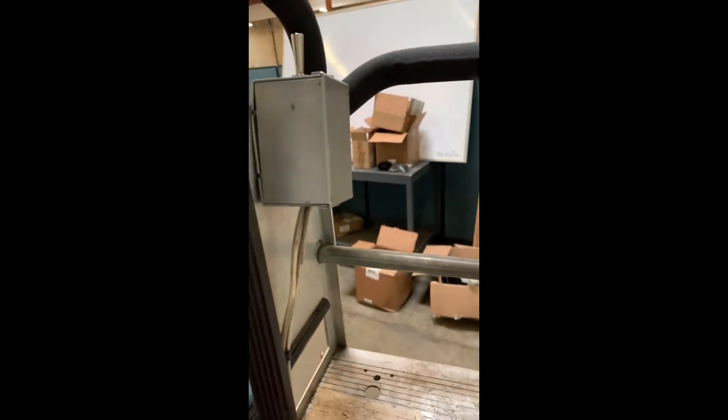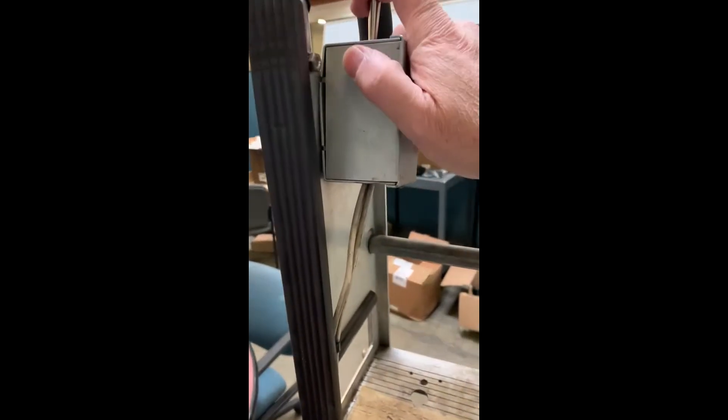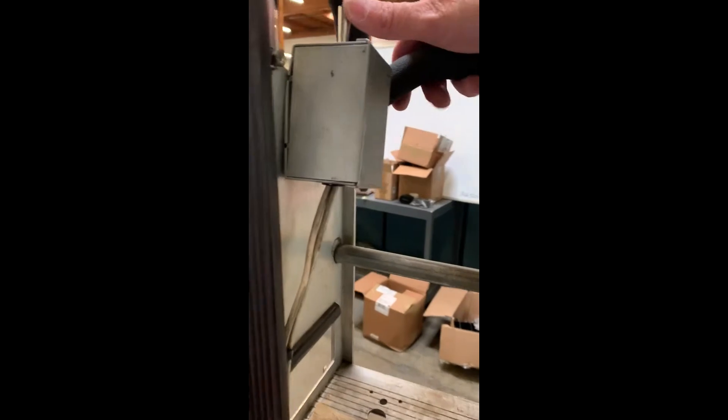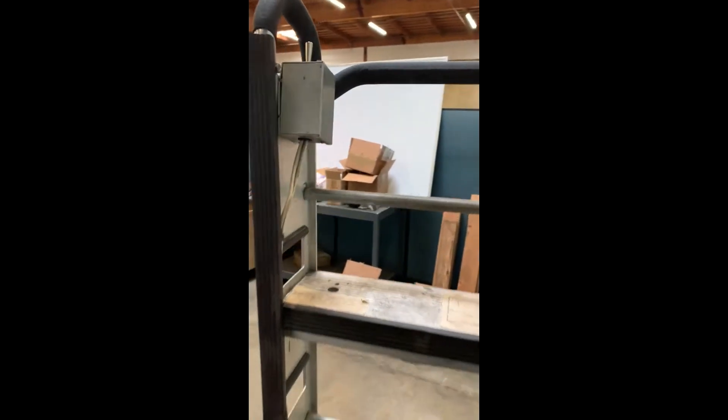This video is about replacing the toggle switch. Why would you want to replace it? Well, a lot of times they get burnt out. If guys leave the batteries plugged in and you plug a charger up to it and somebody comes by and hits that switch to test it, it'll burn the switch out. So you need to replace the switch.